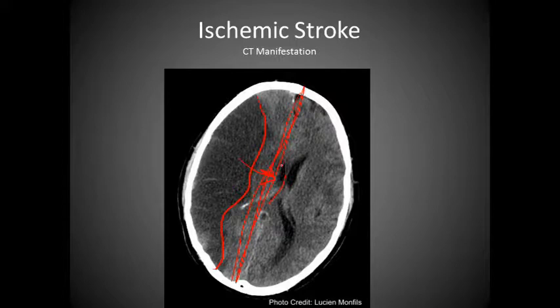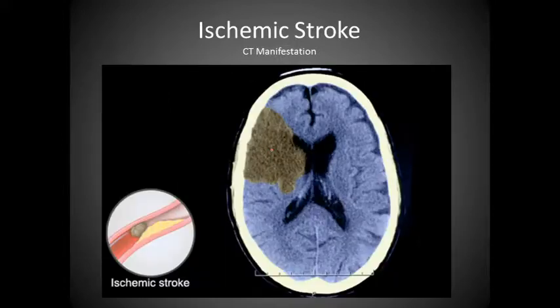Notice there's lack of symmetry. We have compression of the lateral ventricle on the right side, and we have a shift over to where this should be the center point, but between the ventricles, and notice it's not in the line where the center should be. So it's a very obvious midline shift. Let me erase everything so you can look at it again. Very obvious. You just see everything of the brain just kind of pushed over. Very unfortunate.